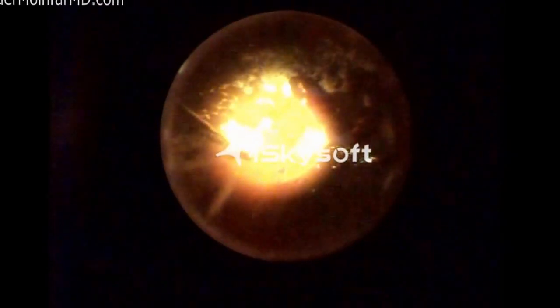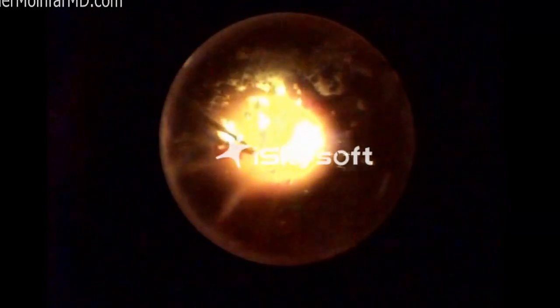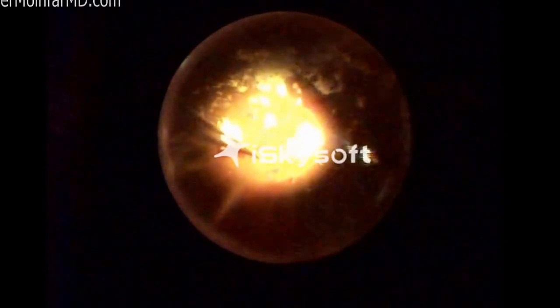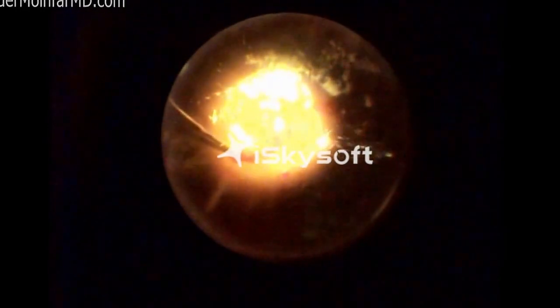So once the vitrectomy is completed, that's pretty much the second stage. The first stage is to get the cannulas into the eye and make sure that the patient's comfortable. The second stage is to complete the vitrectomy, which involves removal of the gel of the eye completely and the vitreous detachment. And then the third stage is to apply laser treatment. Now, laser treatment can be done with fluid inside the eye, or it can be done with air inside the eye. There are pros and cons to each.